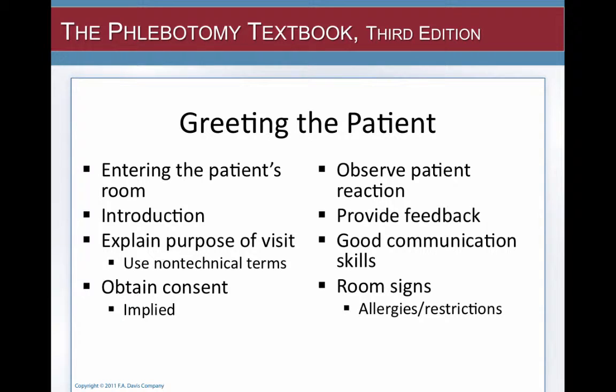Greeting the patient. So when you enter the patient's room, you want to walk in with both a smile on your face and an air of confidence, even if you're not feeling very confident when you first start phlebotomy. It's important that you put the patient at ease. You want to walk in and you want to introduce yourself. Say, hello, my name is Katie Kavner, and I'm here to get a little bit of blood from you if that's okay. Just go slow, make sure you introduce yourself, and have an air of confidence.